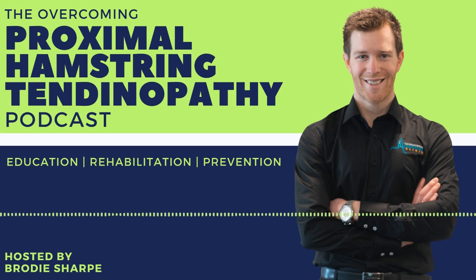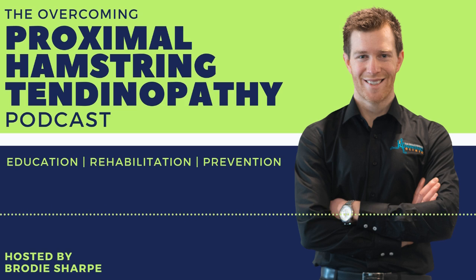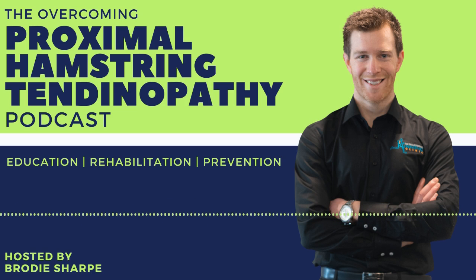It's a modality used to kickstart the healing process through a pro-inflammatory response. It causes a bit of microtrauma, because the idea is that in chronic tendon, your body is not healing. It has reached a point where it's not kickstarting. So what we're trying to do is create a bit of controlled microtrauma. It's quite similar to deep friction massage or dry needling, but it doesn't cause much damage to the skin. It goes straight to the tissue and causes a bit of inflammation and microtrauma. Inflammation is not a bad thing as long as it's not chronic, so your body just kickstarts the healing.